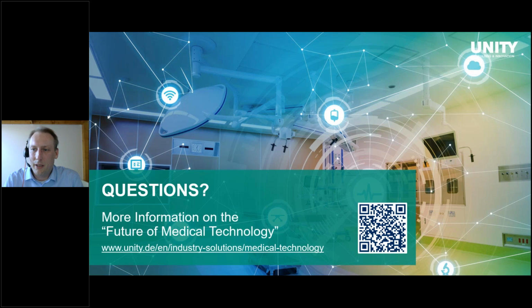One other aspect of it is that the wireless infrastructure, of course, would need to be able to use multicast. This is for the discovery aspect. If we don't use one other option. But yes, it can be used over a wireless IP connection. And I think that's also what we see or will see in the future, that, for example, patient monitors or infusion pumps, as they are already wireless, if they implement SDC, they will definitely do it also via the wireless interface. And I think from my perspective, that's especially also relevant in markets where you maybe don't want to put cables into the wall nowadays.